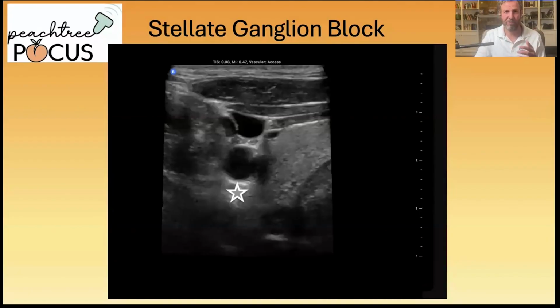But when you're facing refractory VFib and standard measures, including defibrillation and dual sequential defibrillation, aren't working, this is an option to consider. And critically, ultrasound guidance is what allows you to safely place the needle at this target. Success rates, anecdotally from what I've seen, are upwards of 50%. So they're really, really good, and they are done in rare places. And these are for breaking the VFib storm.